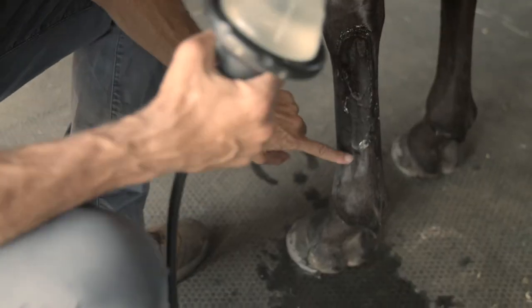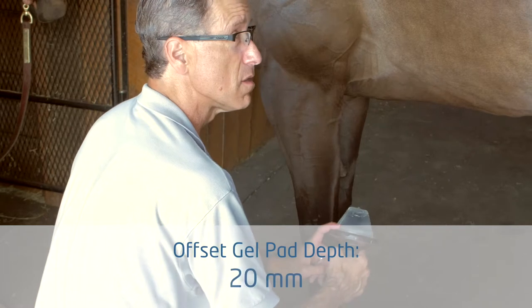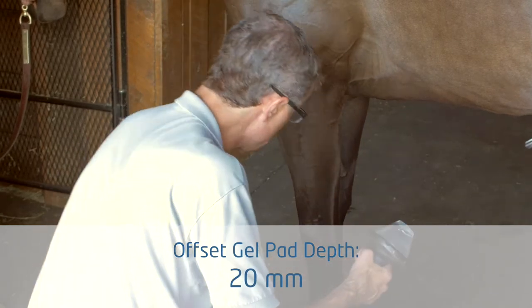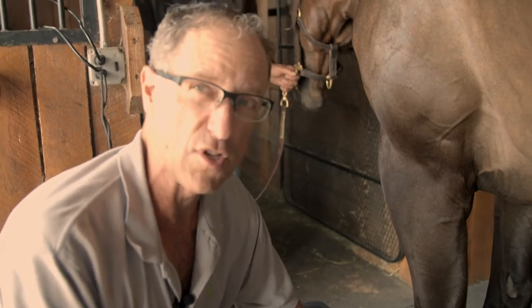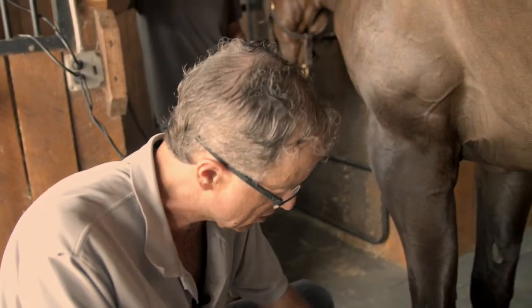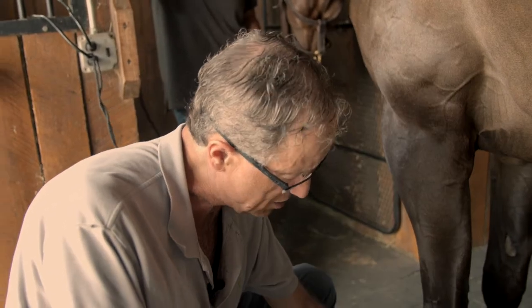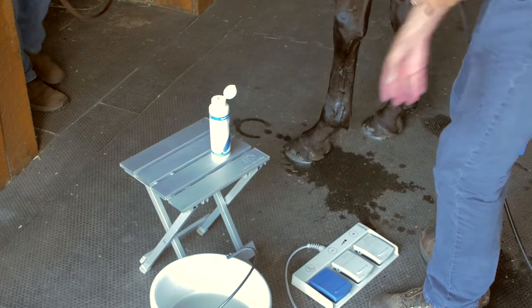On the suspensory branches, you would choose a 20 millimeter offset because it's much more superficial. On the branches, you can even use the linear offset probe, which is really great because you can get a nice contact with it.